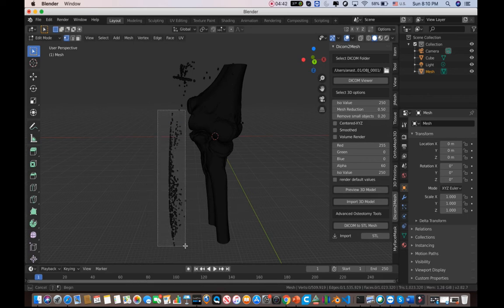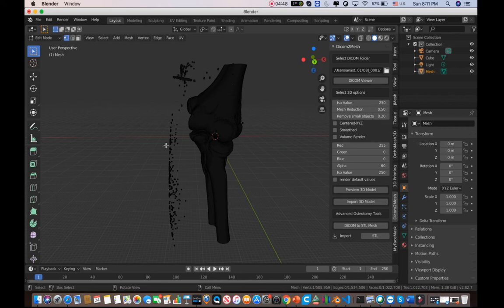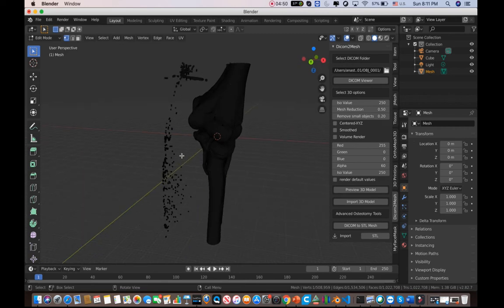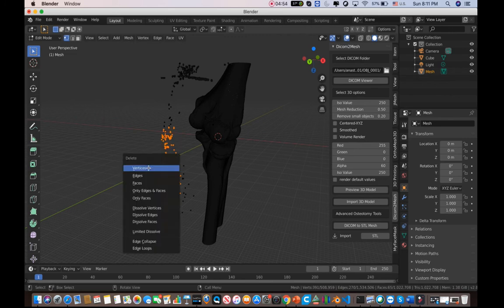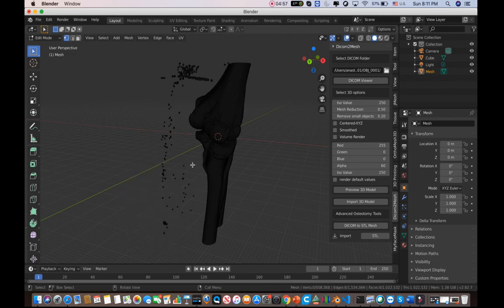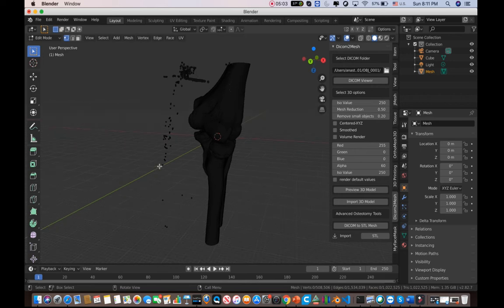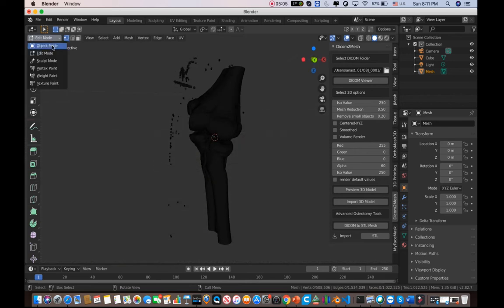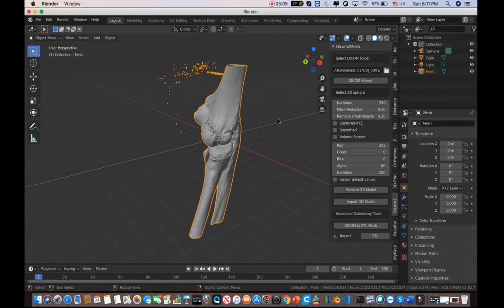And it's going to take a minute to clean all of these extra vertices that we have here, which is artifact. So I don't want to do this here and take all of your time, but if you do this slowly, then you can clean up your model. So this is the updated version.